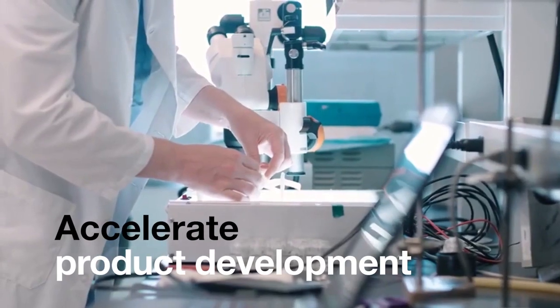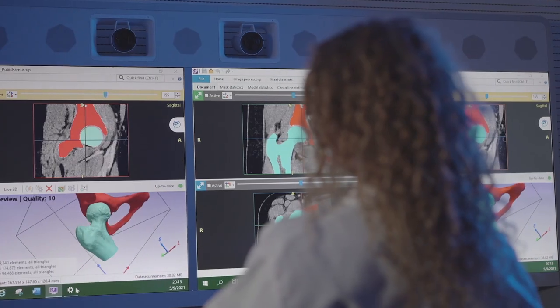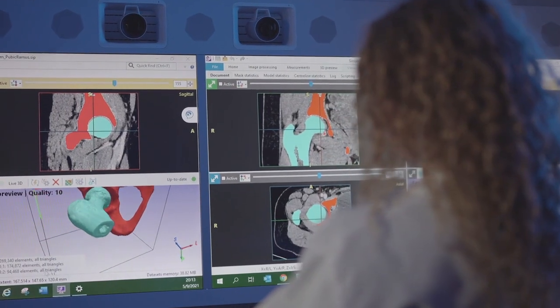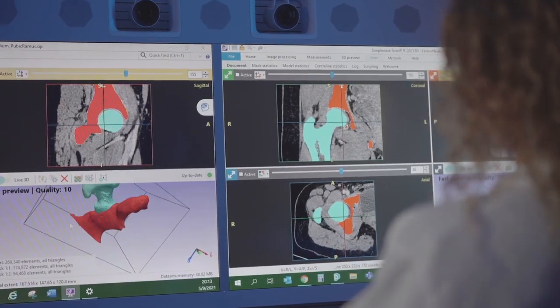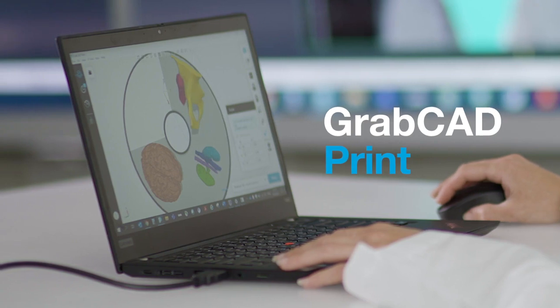And accelerate product development with consistent, high-fidelity samples. Our solution is 510K FDA cleared with leading segmentation software, and customizing models is easier than ever with our GrabCAD print software.